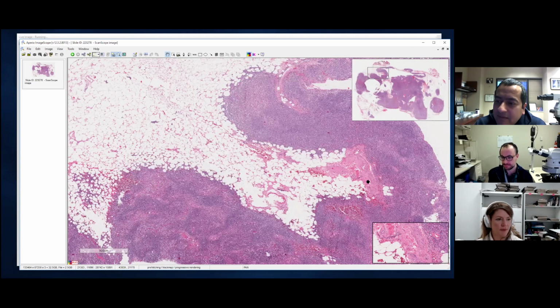So when we look by our staining methods, and I'm going to show you another cool staining method that we just got, which is very helpful in this setting, because typically plasma cells will accumulate that light chain in their cytoplasm, so we can see them by our immunohistochemical stains. But the B cells have that receptor on their surface, so we can see it by flow, but we really can't see it by IHC.